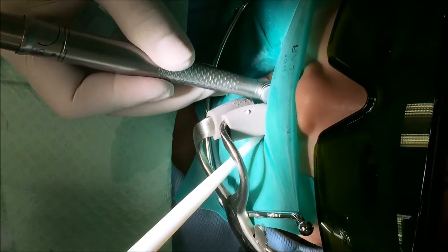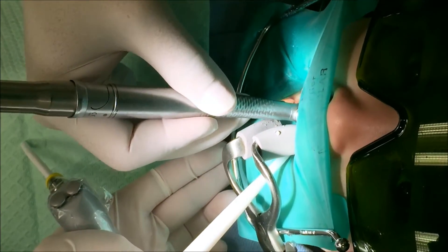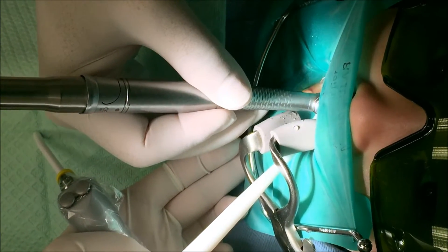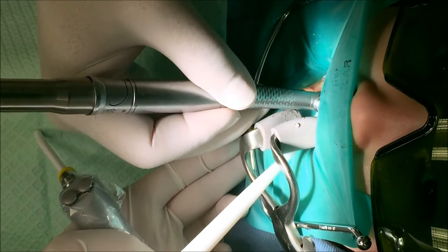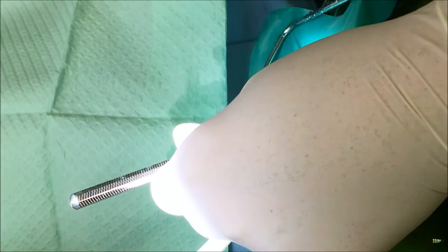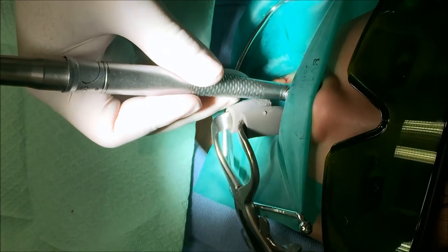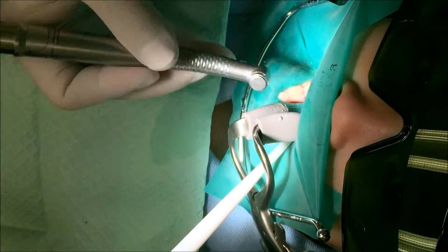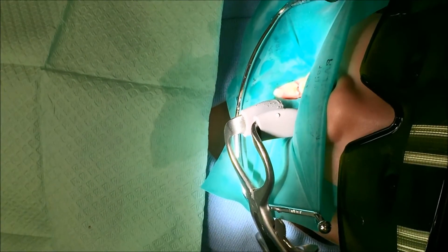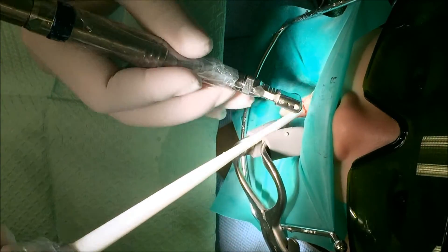Try to stay still for me. Good. I'm going to use this brush here and I have to seal it a little bit. I'm going to use this tickle brush here — it's going to tickle a little bit. Good job.